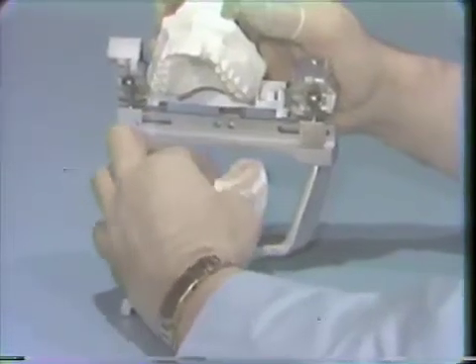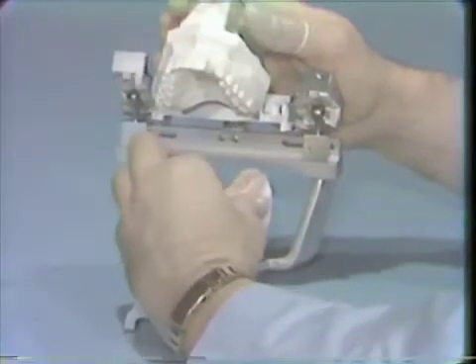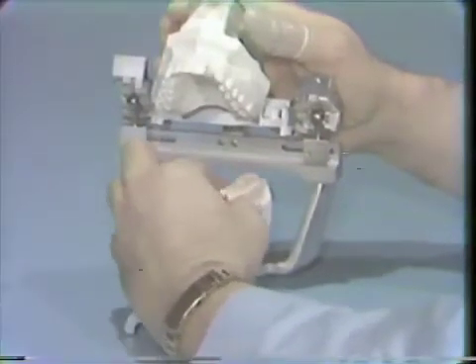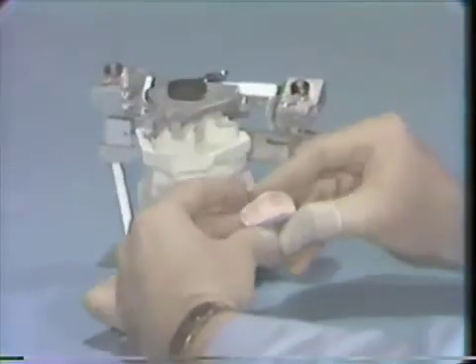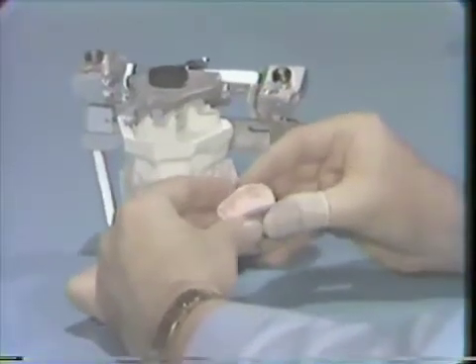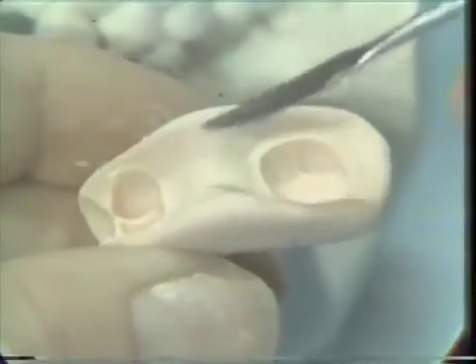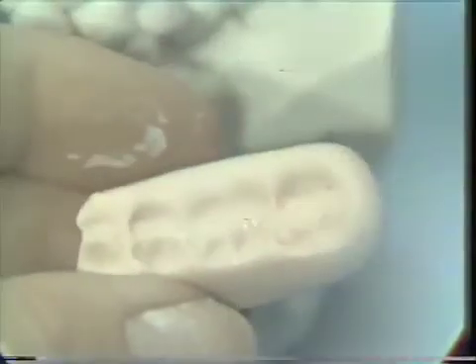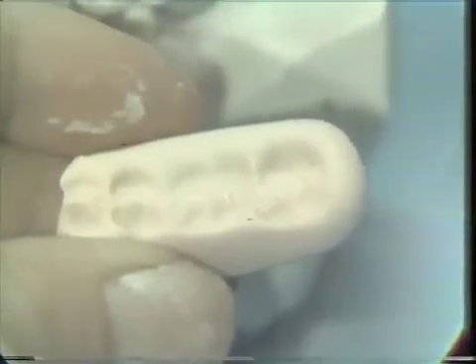It's just going through its polymerization stage. I'll try to tease it off here. Yes. And here you can see that we get quite an accurate registration of the preparations in the material. And as we previously stated, here's the occlusal surface with the maxillary arch registered quite accurately.